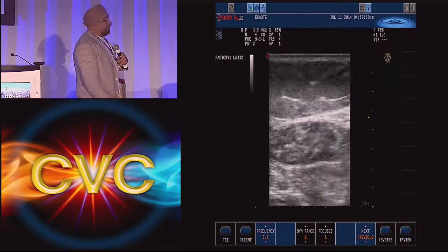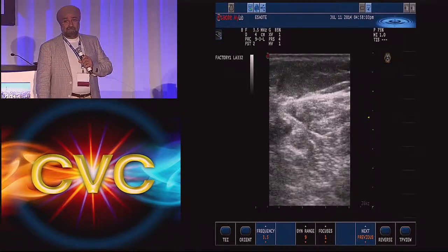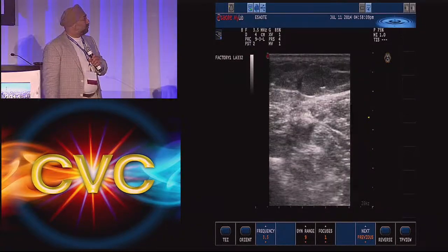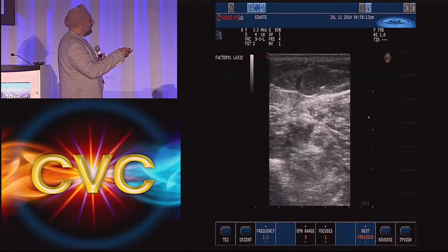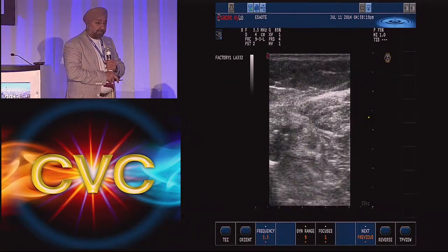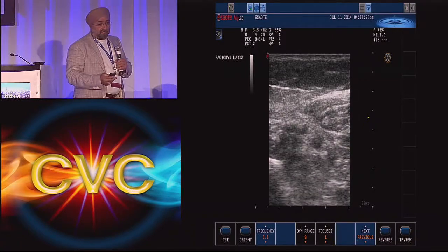How small is the fiber? That goes through a micropuncture. There's one that goes through a micropuncture needle, and one that goes through a 19-gauge needle. There's also a short thermal one, that's the RF, the Venous. Yeah, that is the same thing.